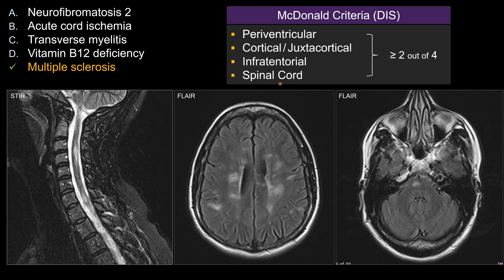In our particular case, you can see a spinal cord lesion, multiple periventricular lesions, a cortical lesion, and an infratentorial lesion. So in our case, we actually fulfill all four categories of the McDonald's criteria for dissemination in space.